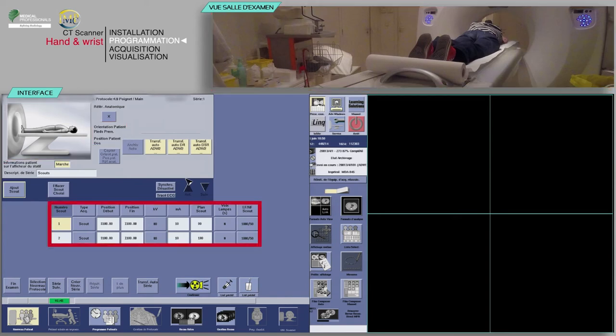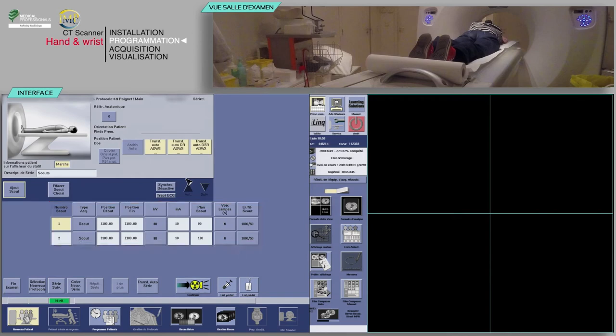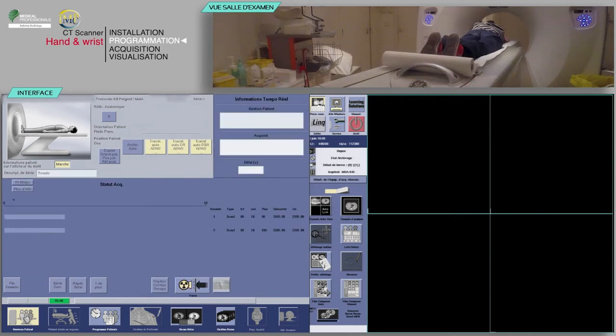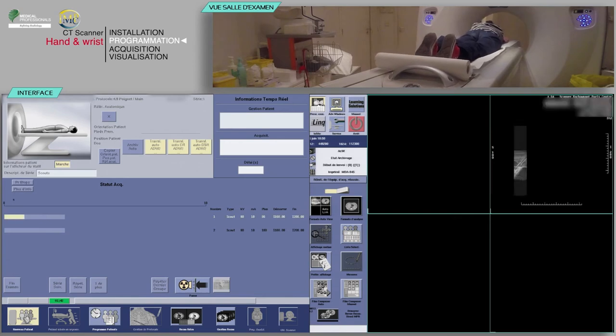After checking the scan parameters, click Confirm. On the keyboard, move the table and scan when the buttons flash.